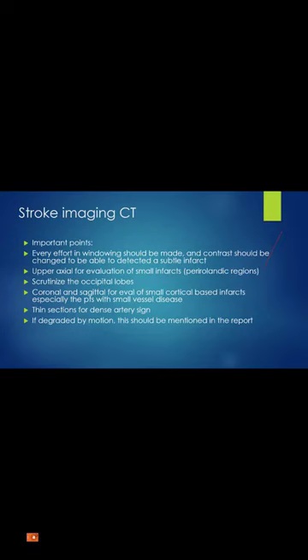If the study is degraded by motion, you should mention that in your report because it lets the clinician know that it is not the best exam. So if there is a potential stroke, at least you are off the hook. They know that you did your best, but this is not the best exam.